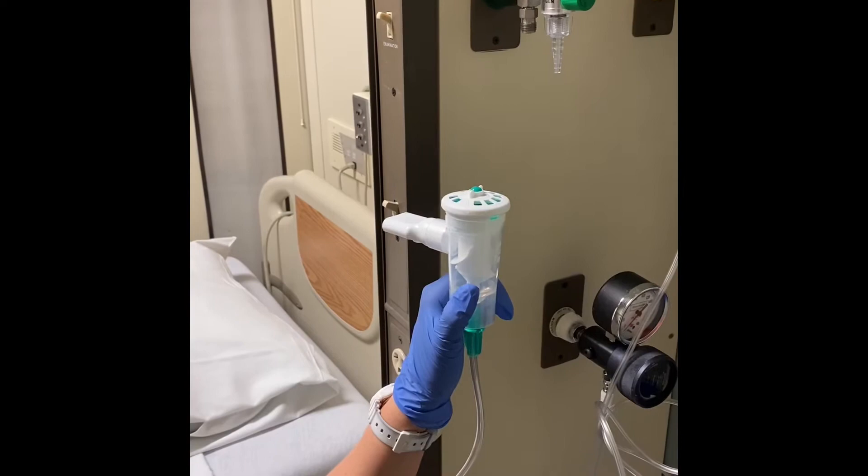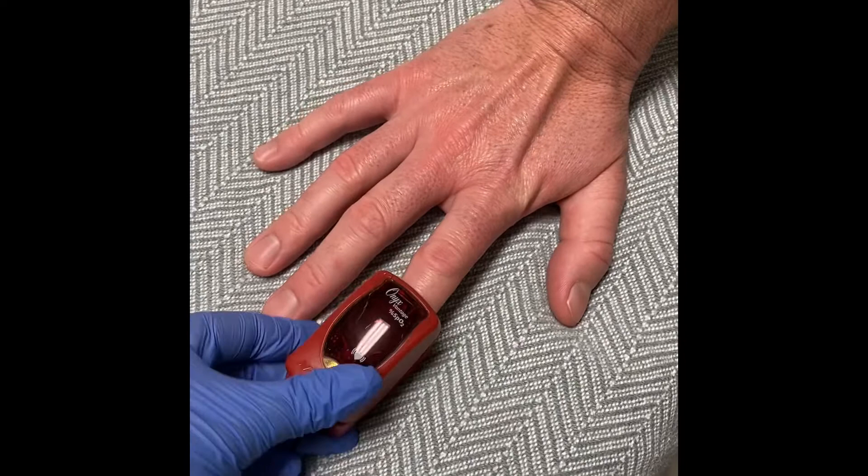Prior to the breathing treatment, you want to get a set of vital signs that include oxygen saturation, heart rate, respirations, and lung sounds.